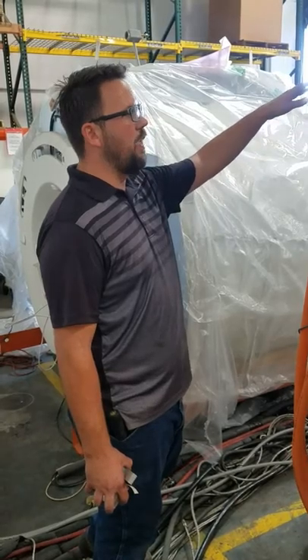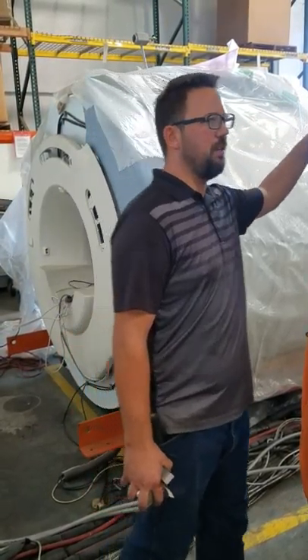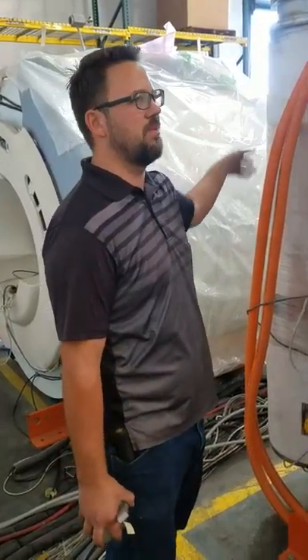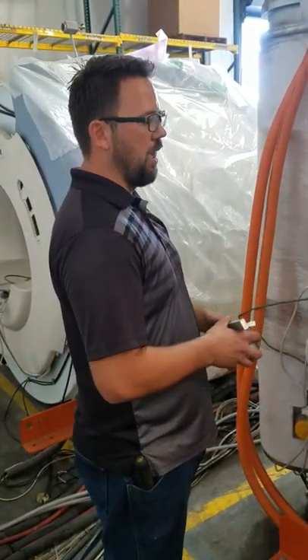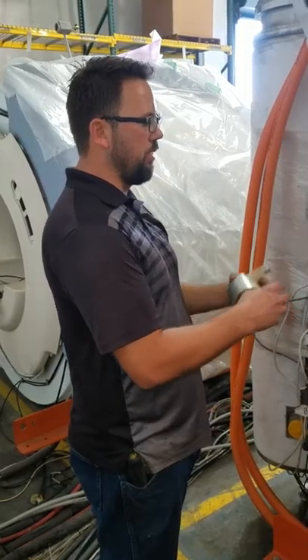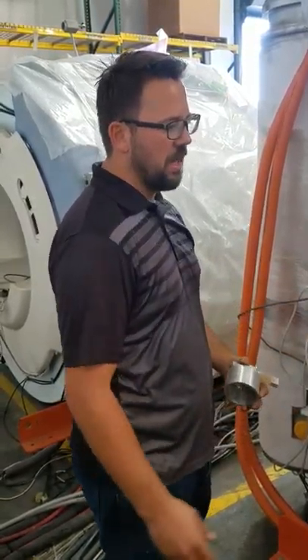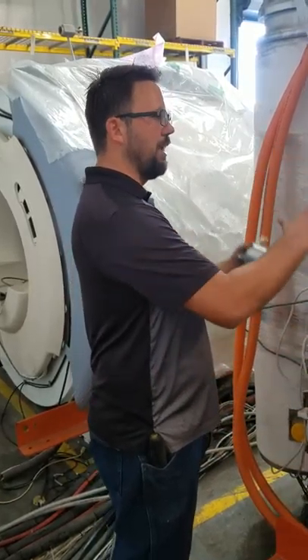To protect the helium chamber from atmospheric temperature, there's a vacuum sleeve. They pull a vacuum which pulls the microns very thin — basically separating the atmospheric temperature from the helium vessel.